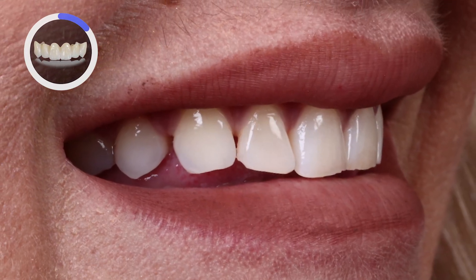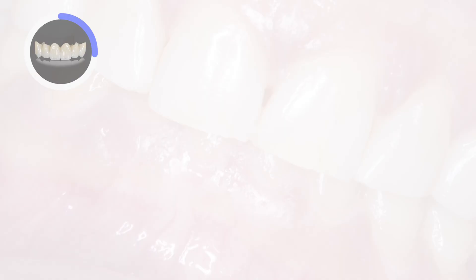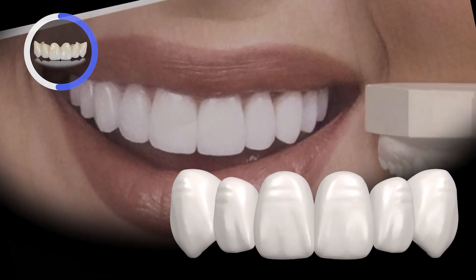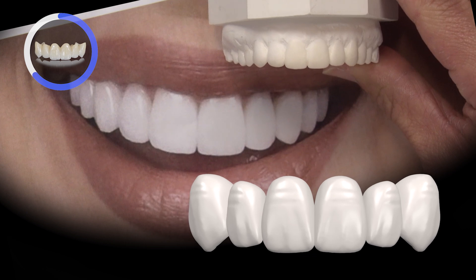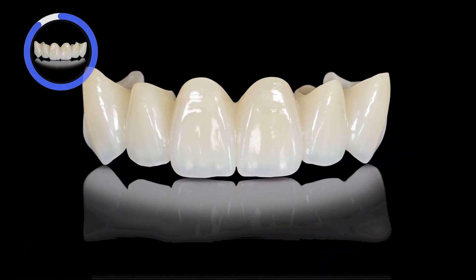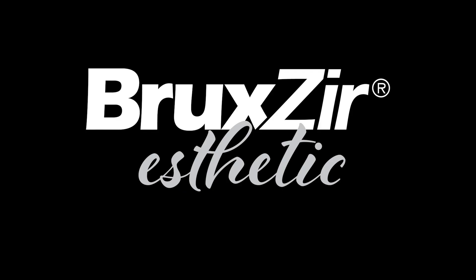The plan is to enhance her smile with veneers — to increase the size, close the spaces, and go much lighter. She wants to aim for a Hollywood BL1 shade using the next evolution in our zirconia restorations: Bruxer Aesthetic.